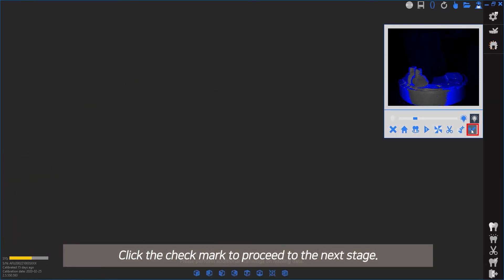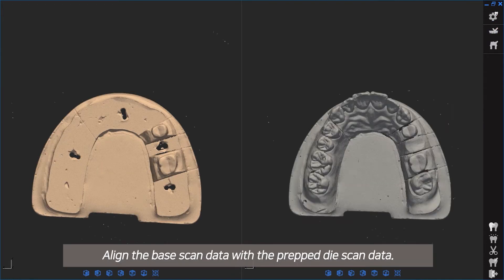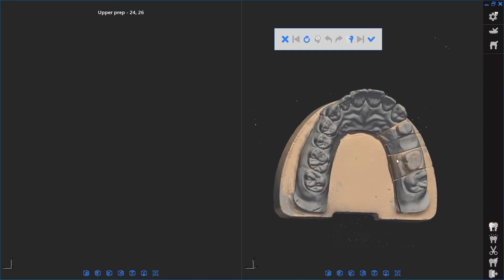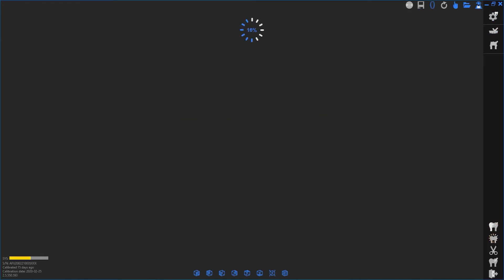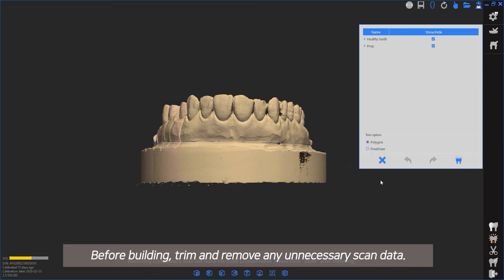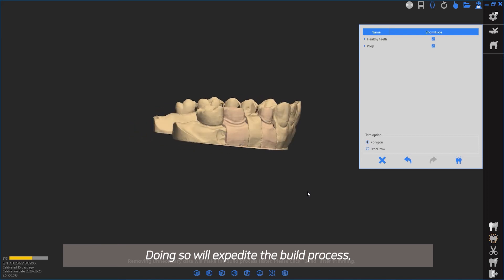Click the checkmark to proceed to the next stage. Align the base scan data with the prepped dies scan data. Before building, trim and remove any unnecessary scan data. Doing so will expedite the build process.